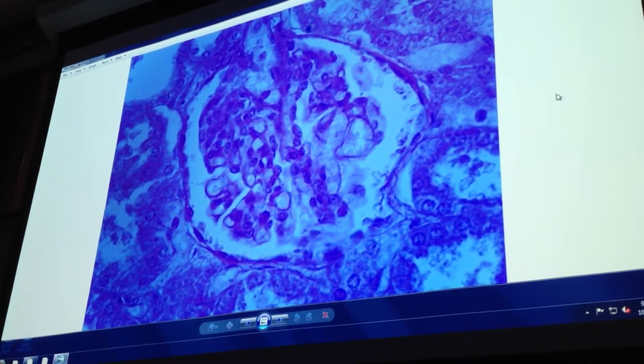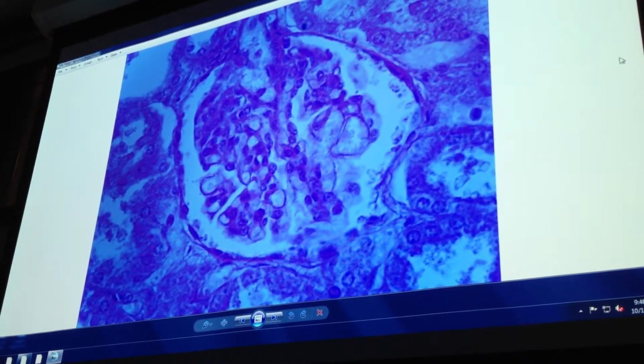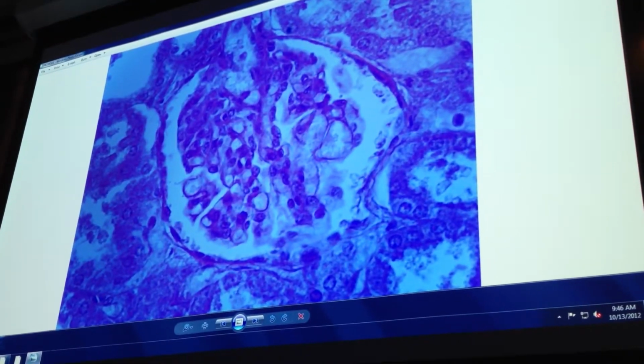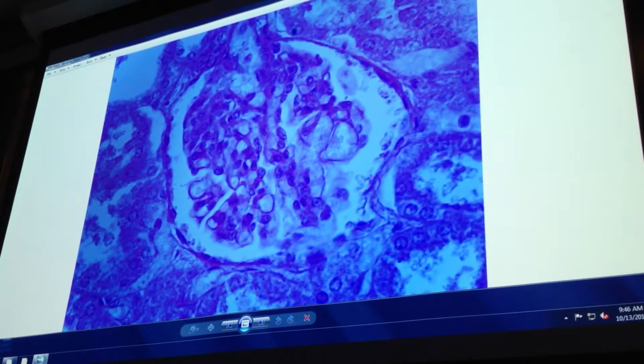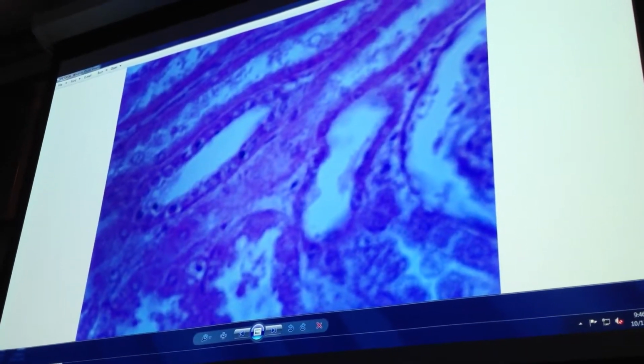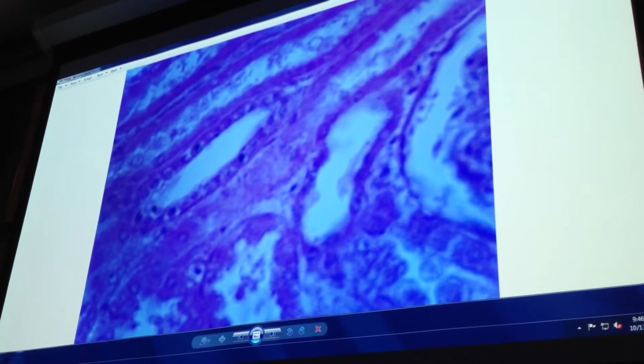Same thing, we just did that. Actually, the other one was a little bit better picture than that. Now remember, when we do the practicals, I'm going to show you the best picture I can. Doesn't do you any good or me any good to show you the worst pictures. Now there's an example of an extremely bad picture.